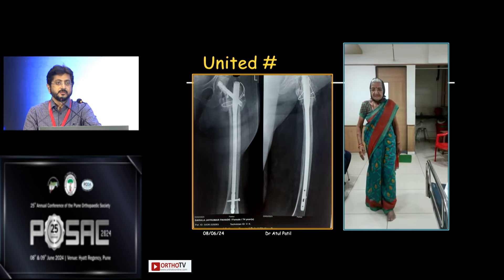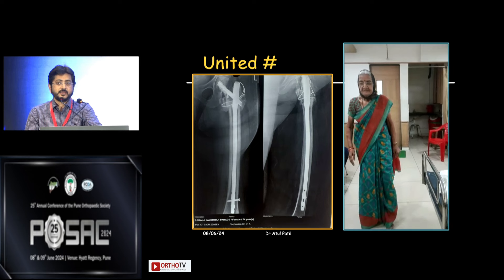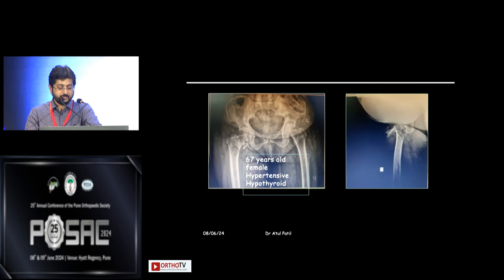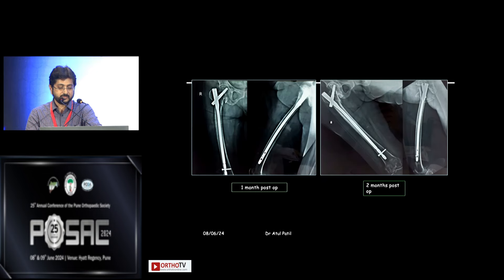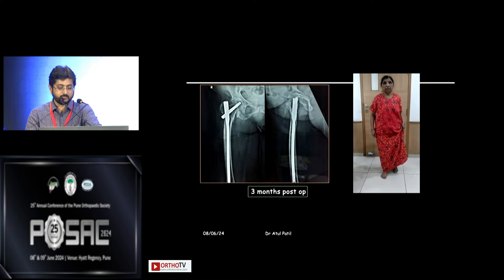Fixation and preserving the native hip is very important. Another 67-year-old lady with an IT fracture — the AP view looks unremarkable, but the lateral shows it is vastly displaced. Closed reduction was possible with Steinmann pins and a long nail, and the patient healed completely and started walking.